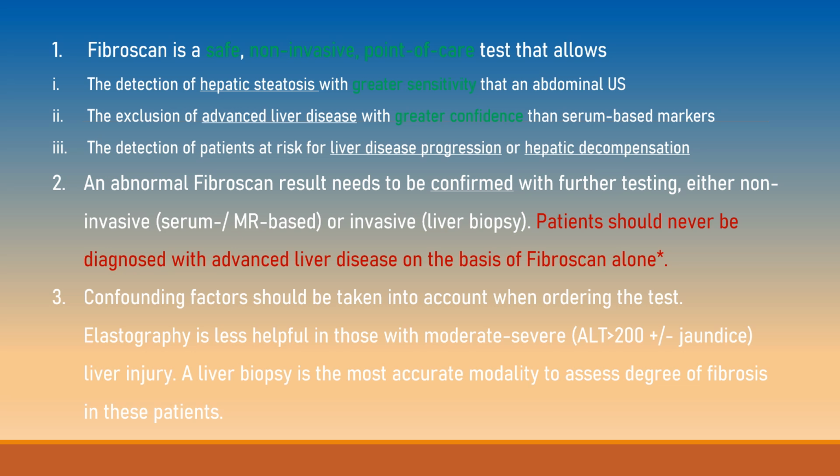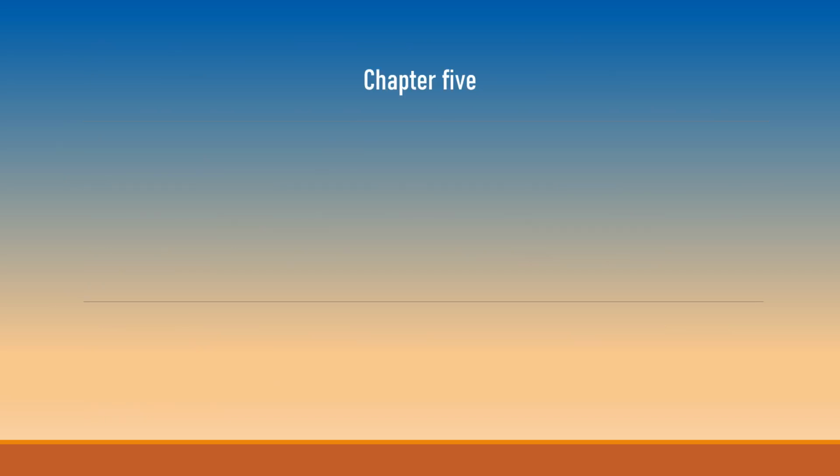Confounding factors should be taken into account when ordering the test or performing it. So elastography is less helpful in those with moderate to severe liver injury, so a liver biopsy is the most accurate modality to assess the degree of fibrosis in these patients. Where do we go from here?